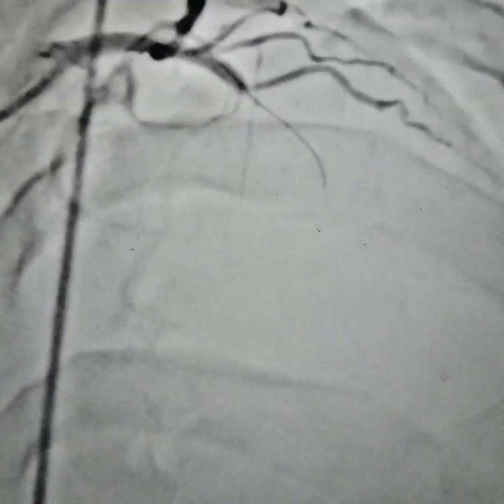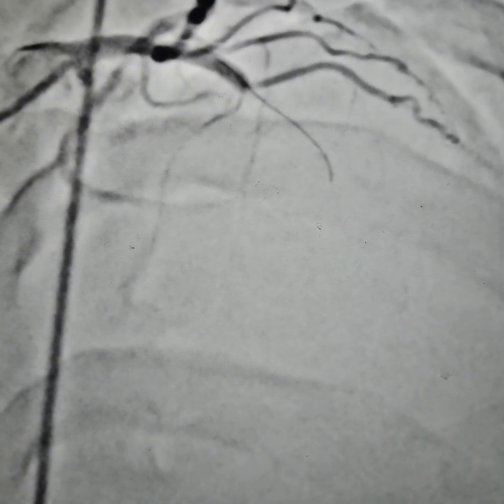We started wiring first with the BMW wire, or workhorse wire, but it was not able to cross the lesion. We then used a whisper wire and luckily it was able to cross. You can see the lesion has been crossed successfully.